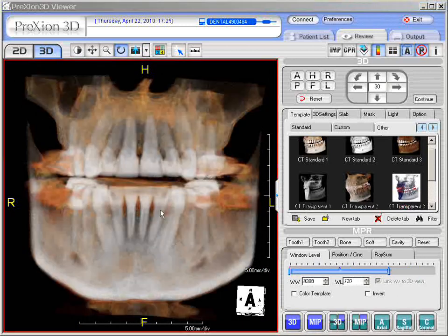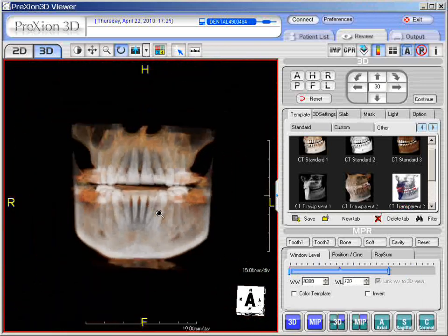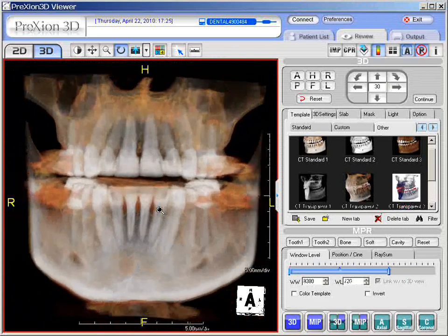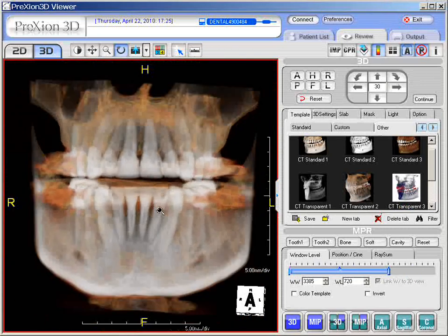To zoom the image, simply press down on the center wheel — don't scroll it — just move the mouse north for magnifying and then move it back down south for zooming out. So it's a resizing action performed by pressing the middle wheel down and moving the mouse north and south.